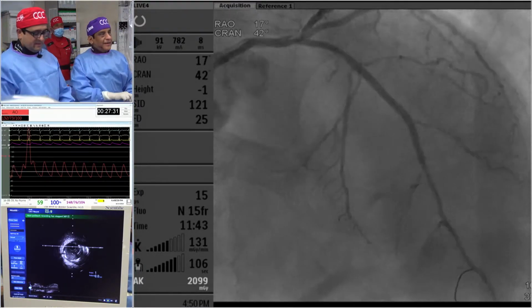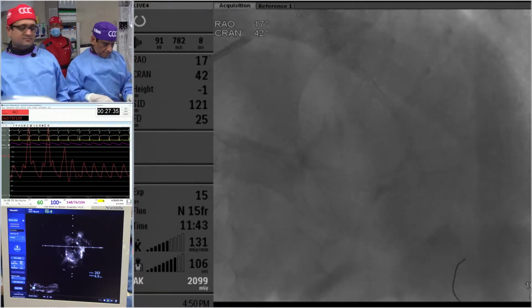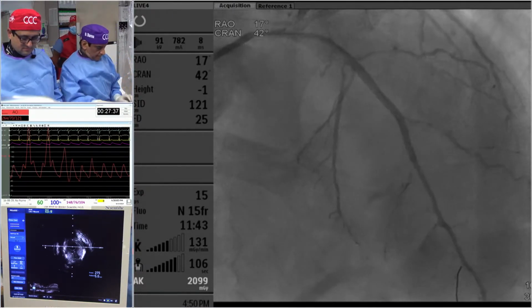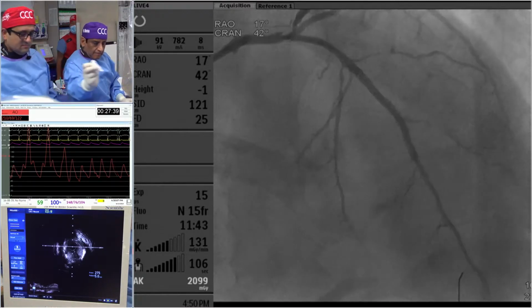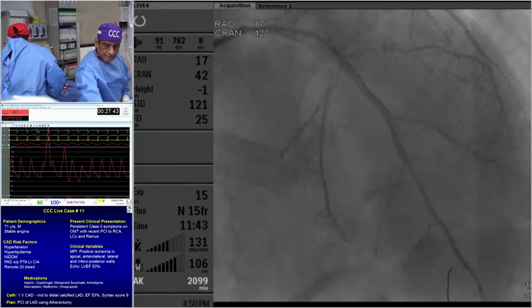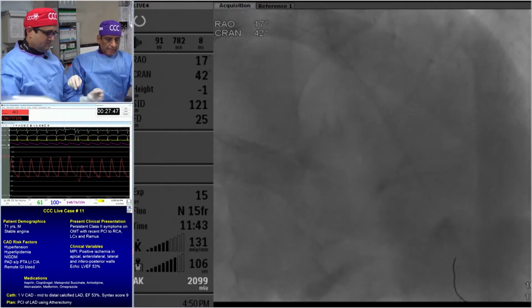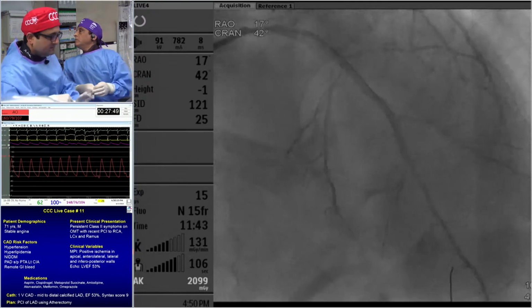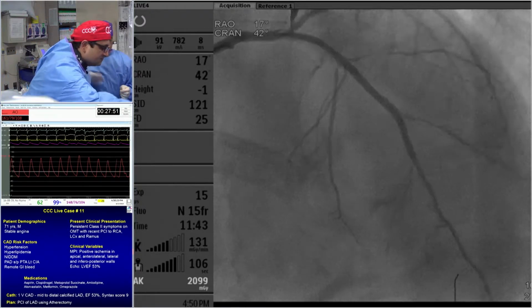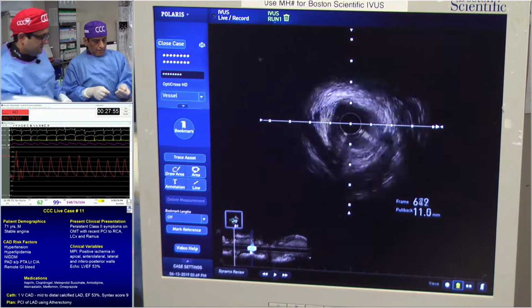So, Pedro, you did a lot of lipid pool lesions like that probably as well. What did you see there in terms of LCBI, and what's your take? You're an expert on vulnerable plaque. Is this a vulnerable plaque or not vulnerable? Well, I think when you have these craters, which Rioufol described when he said there were 5 ruptured plaques per patient, these craters are harmless.